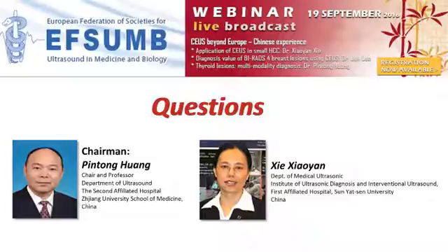Normally in China, ultrasound is performed earlier, prior to the CT and MRI examination. In this state, normally the patient has not had CT or MRI, and we couldn't know whether the patient has tumors or not on B mode ultrasound.